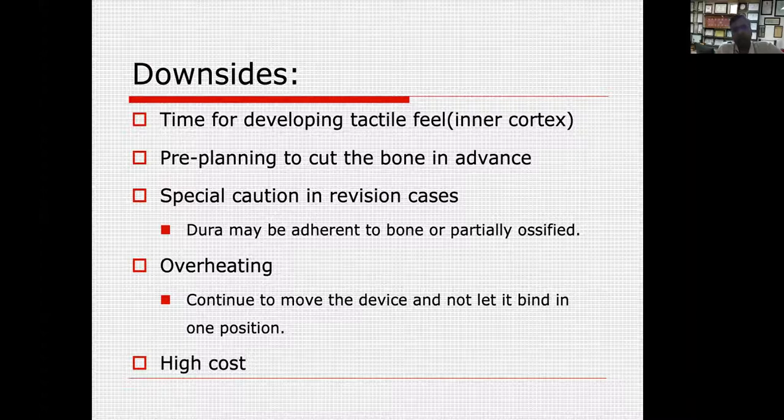You need some time for developing tactile feel. Again, 12 to 15 cases are good enough. You need to pre-plan to cut the bones in advance. Take special caution in revision cases because the dura may be adherent to the bone. Regarding overheating, you have to continue to move the device and not let it bind in one position. And high cost is certainly one of the major downsides which people talk about. But if you look at the longer term, it is much more cost effective.